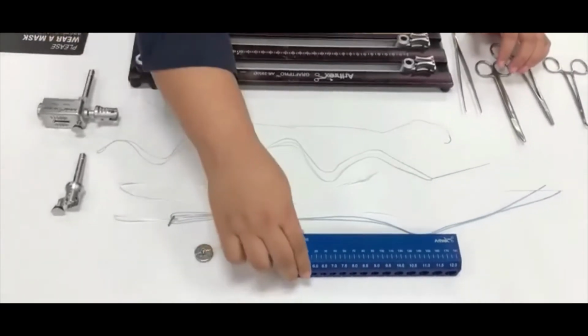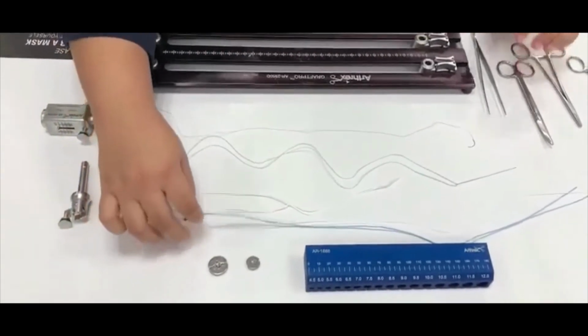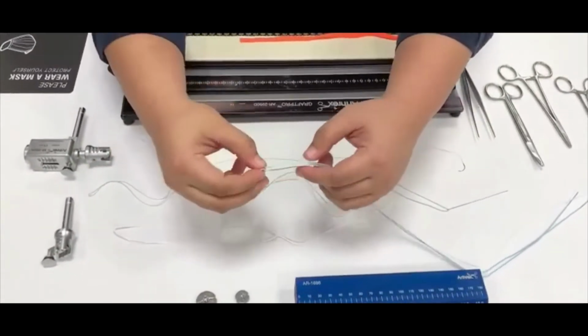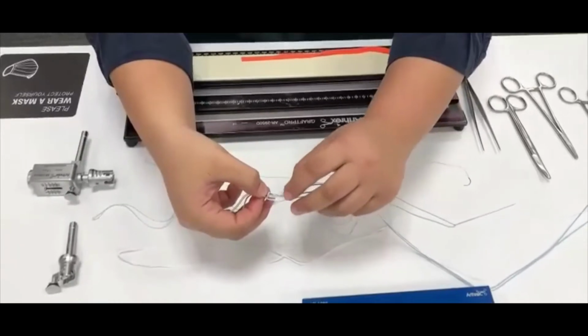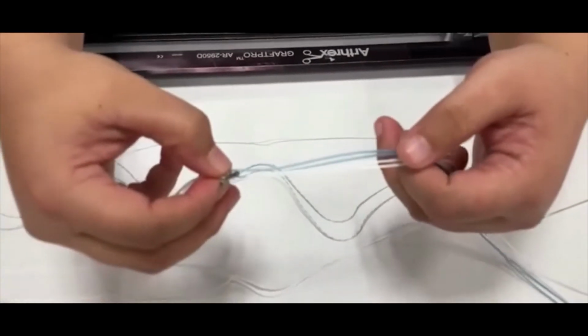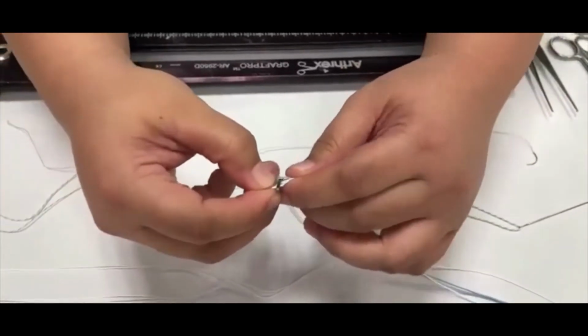What you will need is a sizer. Okay, you will need a TightRope RT. This is for the femur part. As you can see, there's a blue suture which is the leading suture, and the white suture is the cinching suture or the shortening suture. It's already attached to a button.